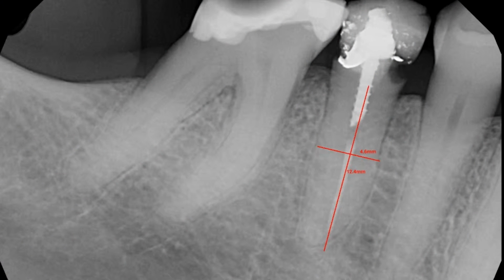So looking at this periapical radiograph, you can see that we're using some treatment planning software to determine the actual width and height of the residual socket once this tooth number 4-5 is going to be taken out. So from this radiograph, we can probably plan for an implant that's going to be slightly wider than 4.6 millimeters, and we can go anywhere from 10 to 13 millimeters safely in this case.